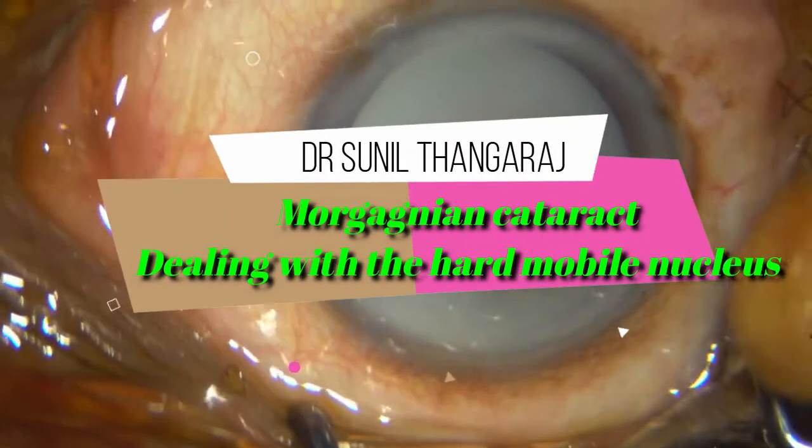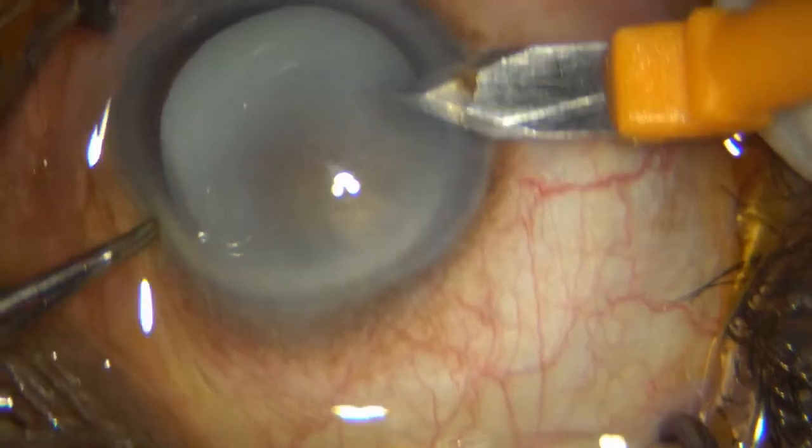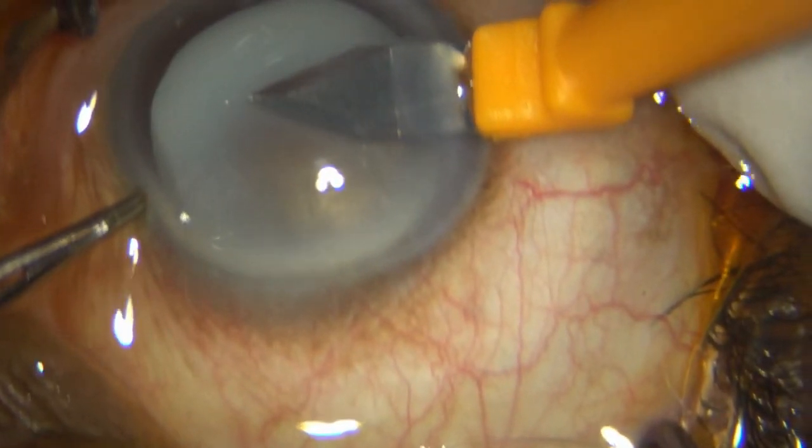This is a pretty advanced hypermature cataract. In fact, it's a Morgagnian cataract, and unfortunately this lady is bilaterally blind with such advanced cataracts.